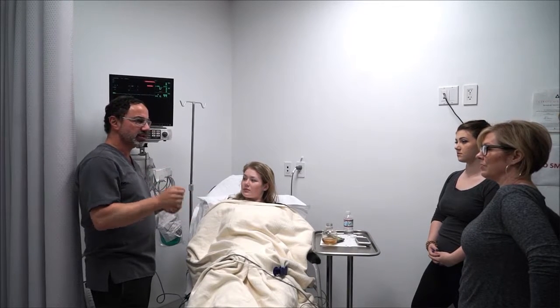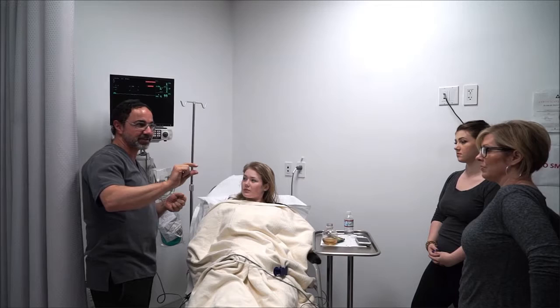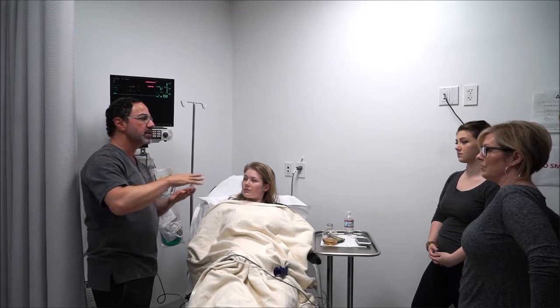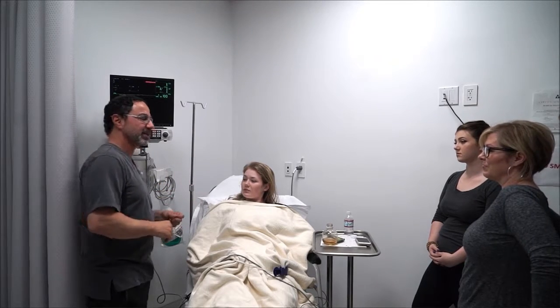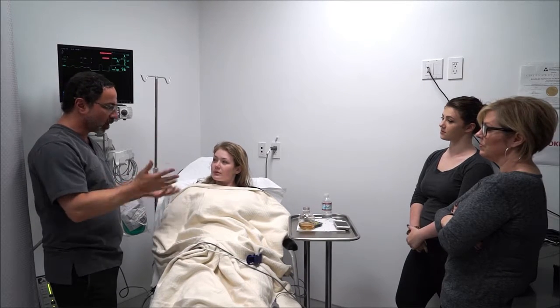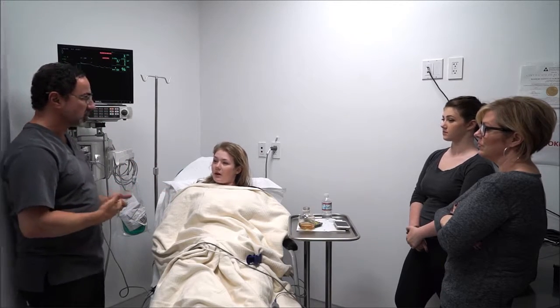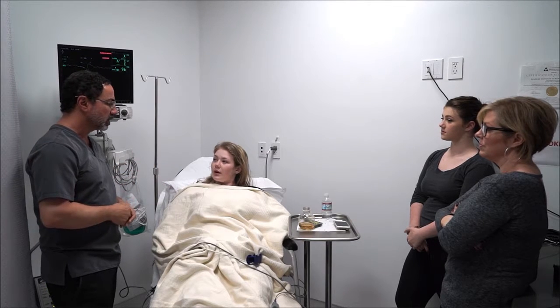That combination of dense fibrous tissue and a thinner layer of fat, because she doesn't have that big thick layer anymore after the weight loss, and then the looseness of the skin, makes it very challenging from a technical standpoint. We used the VASER to release that fibrous tissue. It's going to help with the skin retraction, and then the whole sculpting, the power system liposuction.